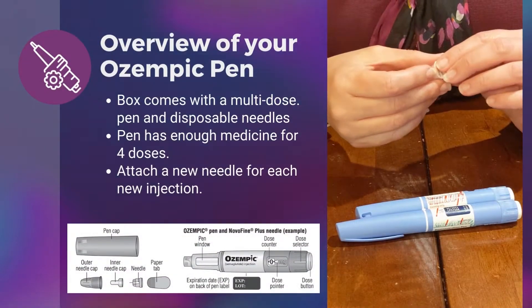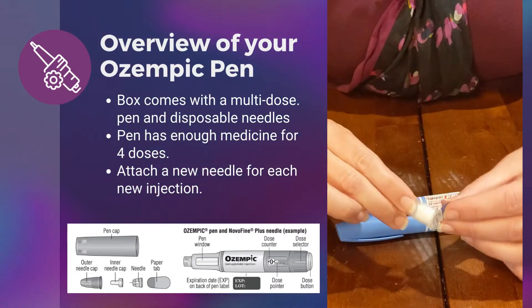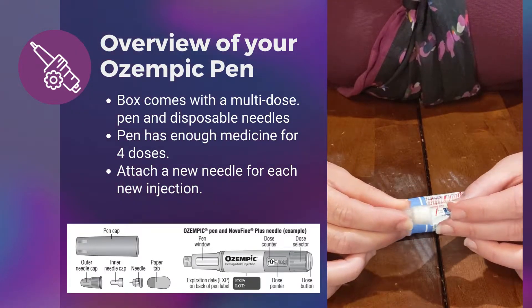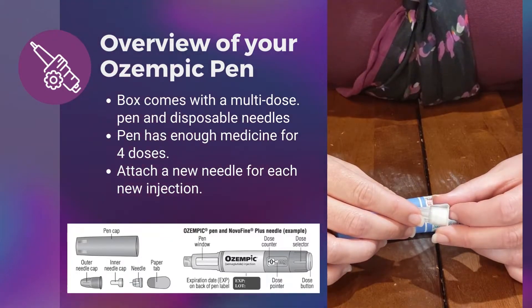Ozempic is a multi-dose pen that is dosed once a week. One thing you need to know is that you need to attach a pen needle each week in order to give your injection. You'll receive a pack of six needles with your Ozempic pen.